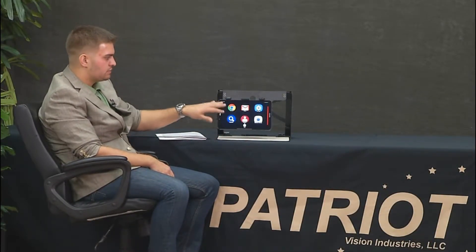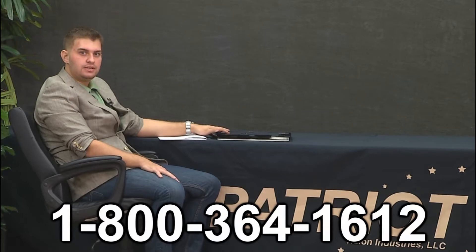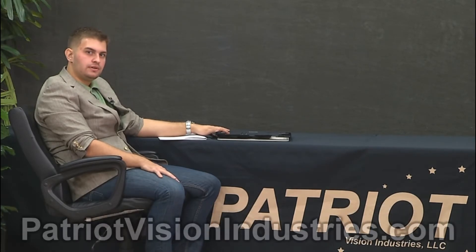It's a fully operational Android device, so you can browse the web, watch YouTube videos, watch Netflix, and check your email — everything you'd do on a Samsung Galaxy Tab A. Folding it back in, it goes right inside the carrying case — a perfect portable solution for going from classroom to classroom or taking it home. For questions about the Patriot VRM 10, call 1-800-364-1612, visit patriotvisionindustries.com, or check out more videos at youtube.com/magnifyingamerica. Thank you and have a great day.